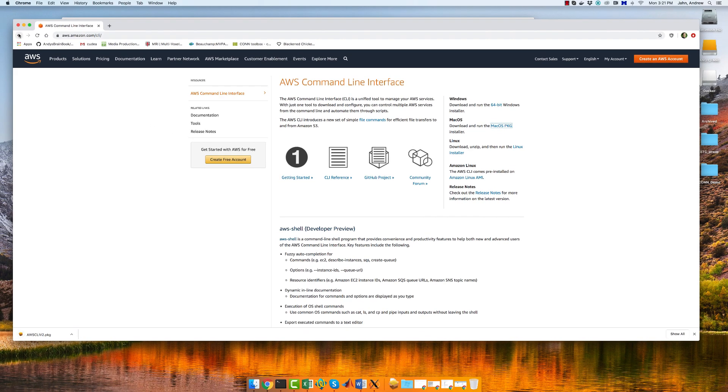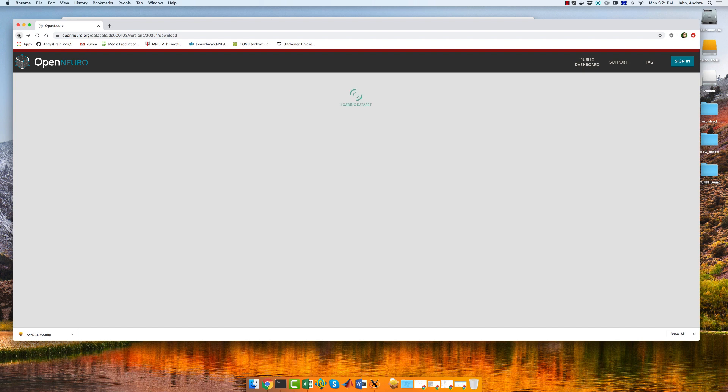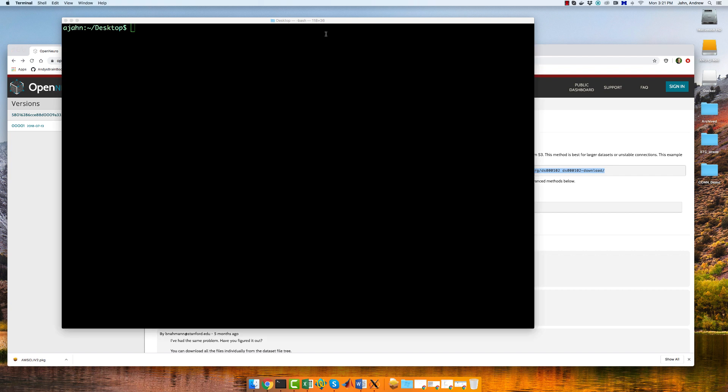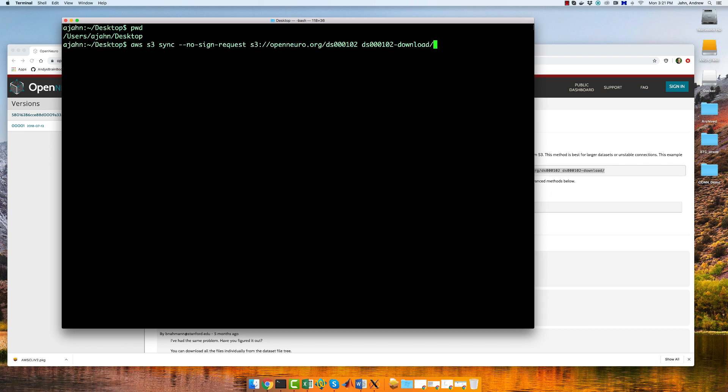Go to this page and download the appropriate AWS client for your operating system. Once it has installed, open a terminal, navigate to the desktop, and type the following. Or simply copy and paste it from the OpenNeuro page.